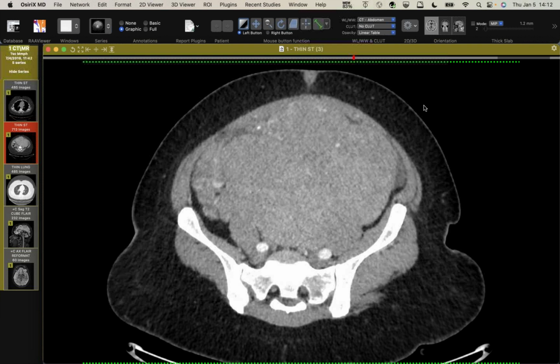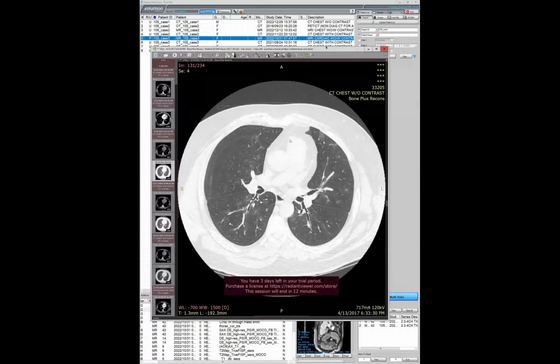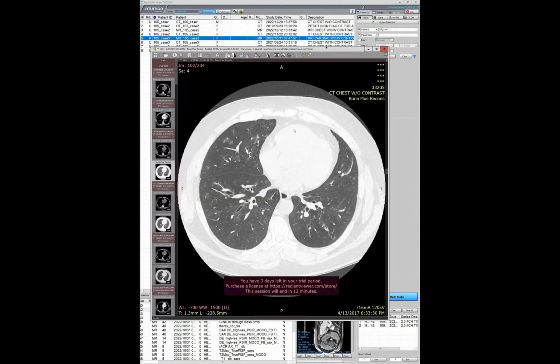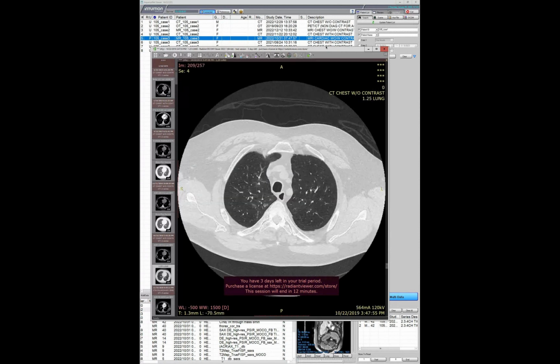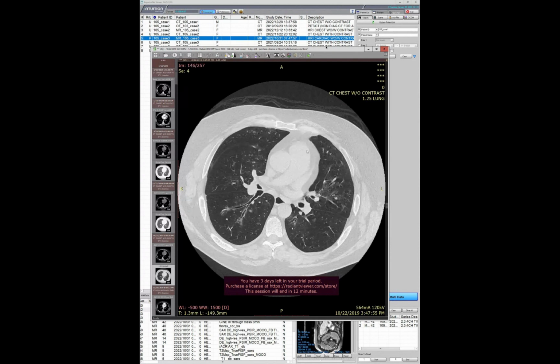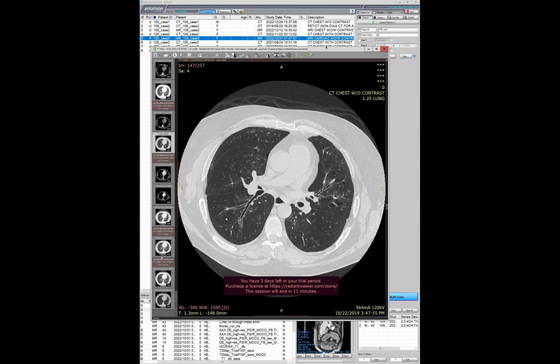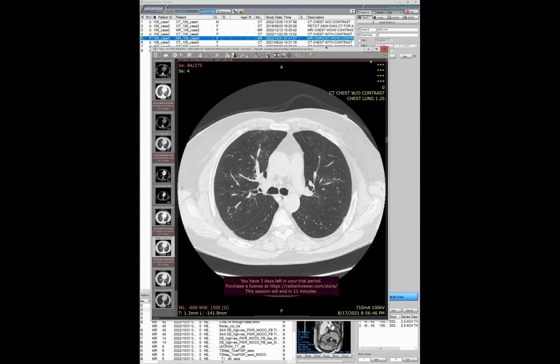Where's my screen? Is that it? Anyways, I'm just going to show this real quick because Jeff shared a case with us earlier. I'm telling you, it looks so similar, with this peribronchiolar ground glass. He shared a case with us earlier and was wondering what it was. This is what he developed over time, and it looks just like my case from this morning. I'm like, oh my God, it looks exactly like it. And I just pulled up the case now, showing it, this patient with GPA. But anyways, I don't know if that's at all related.